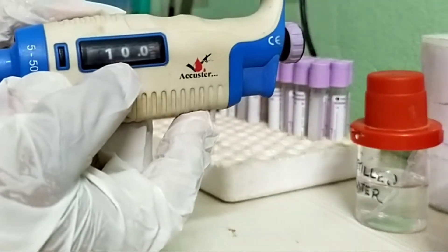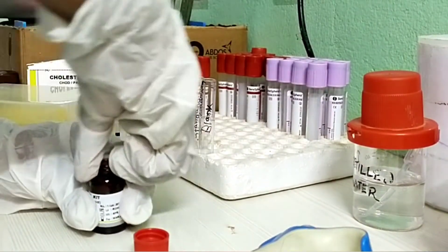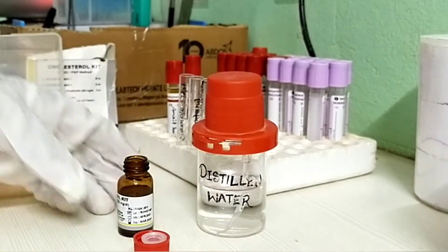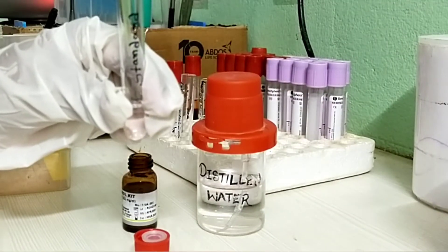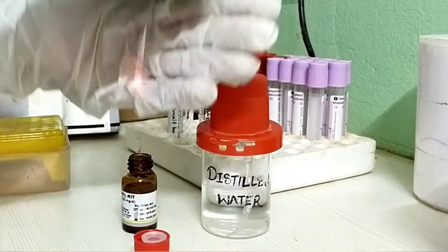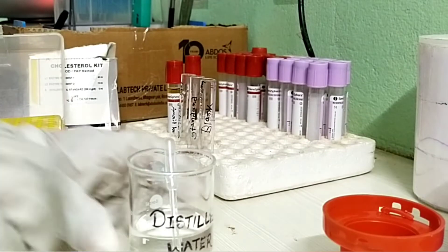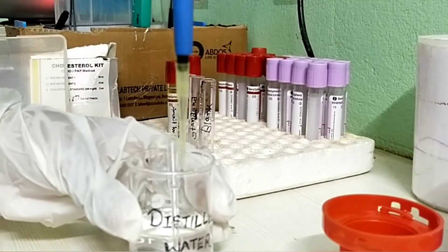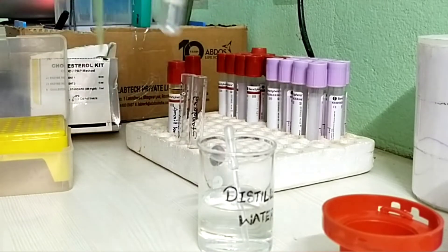Set the pipette at 10 micro liters. Take 10 micro liters of standard reagent in the standard marked test tube and mix well with working reagent. Now take 10 micro liters of distilled water in the blank marked test tube and mix well with working reagent.